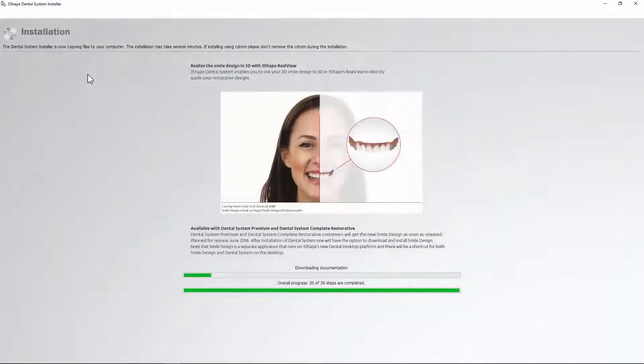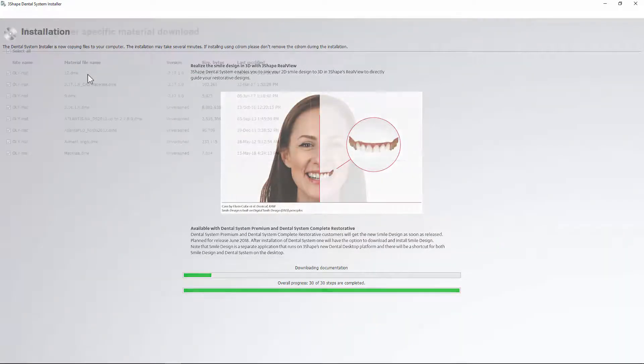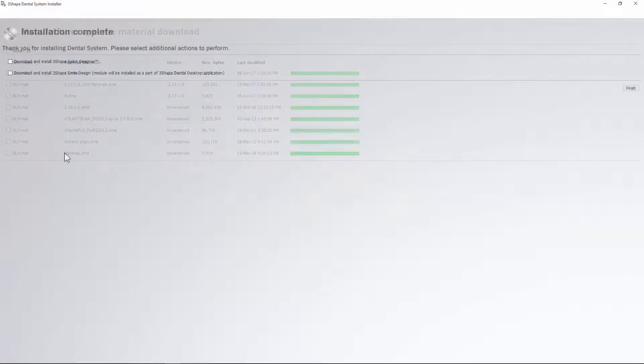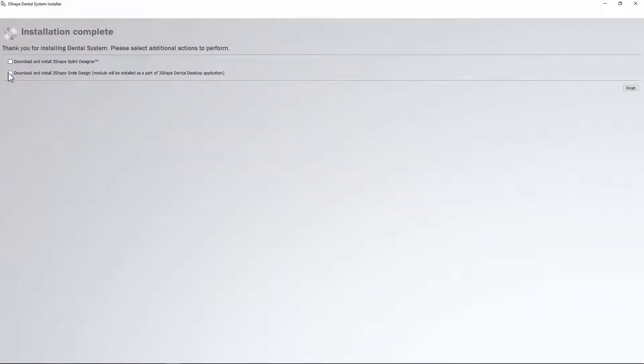On the last screen, you can enable the download and installation for the additional applications. Please mark the Smile Design checkbox to start the download and installation of it.